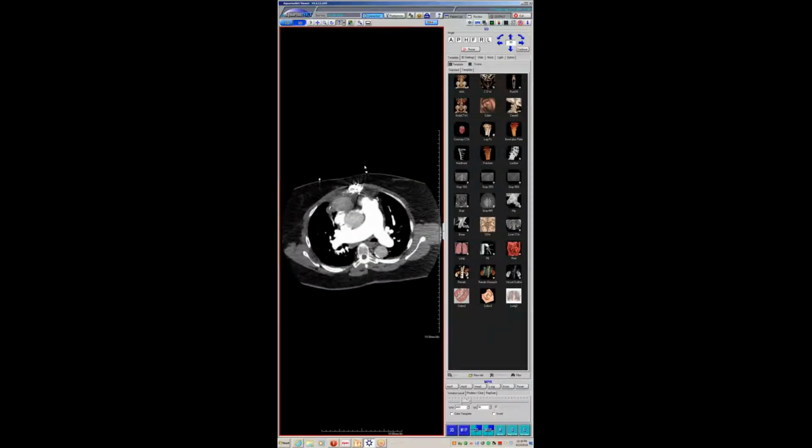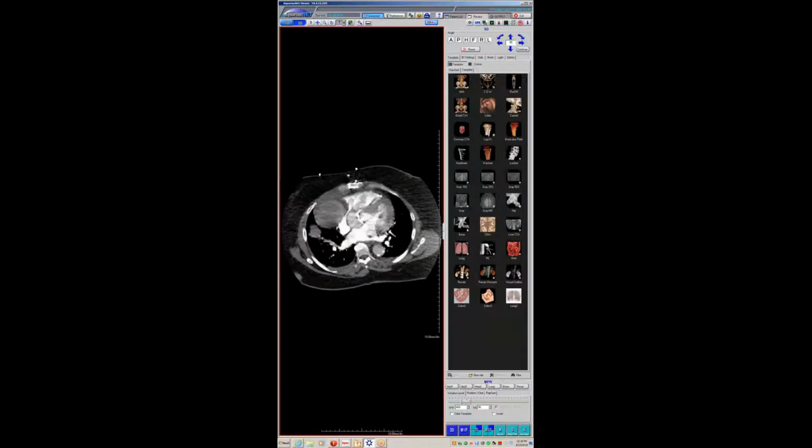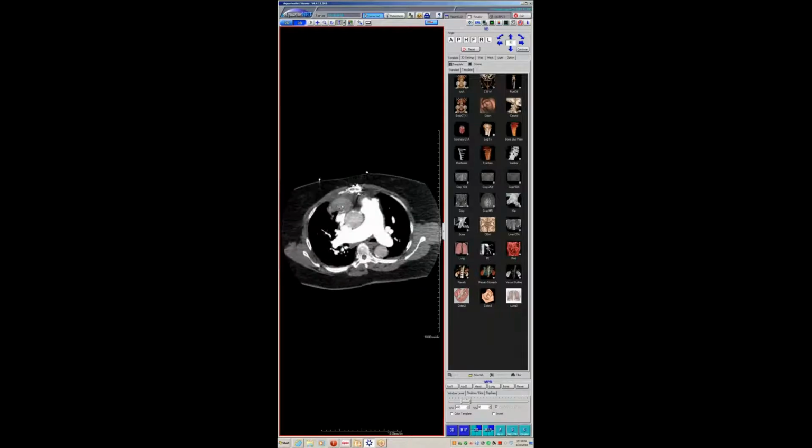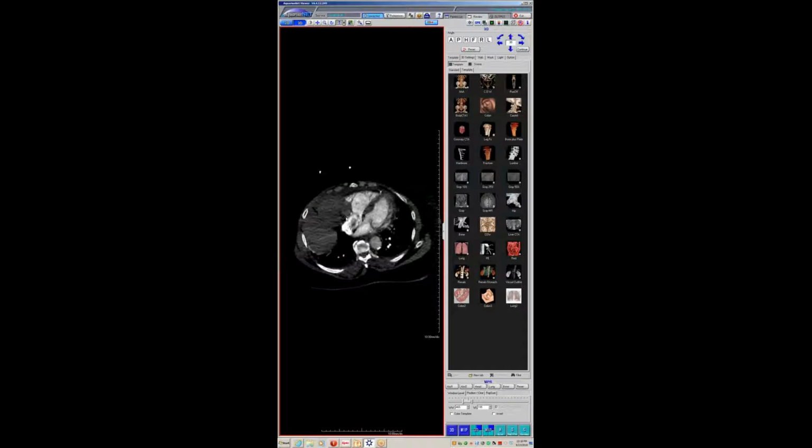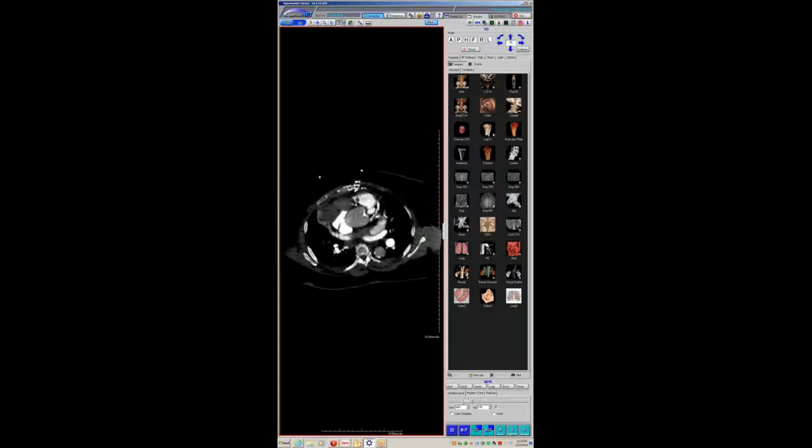I think most people, if you were looking at this, would notice that there's some sort of abnormal connection with the aorta here. But if you're quickly perusing it, you might just think it's some sort of cardiophrenic angle, potentially even a bilobed anterior mediastinal mass. You can see that the edges are calcified, that it's actually compressing the RA and RV.